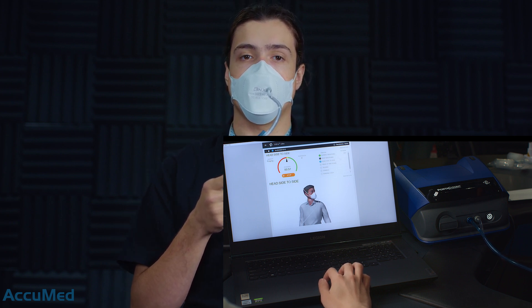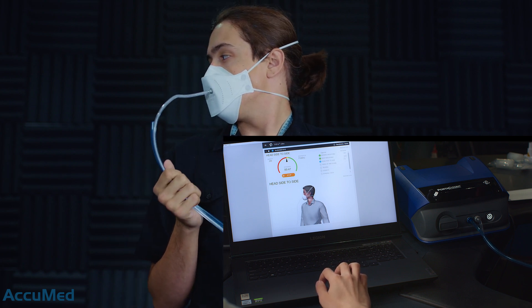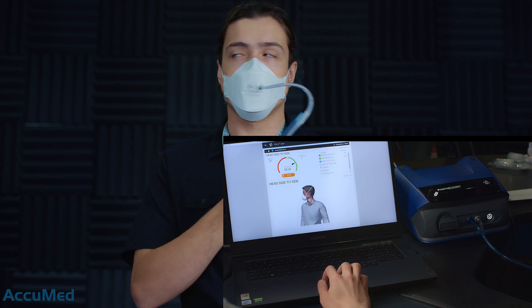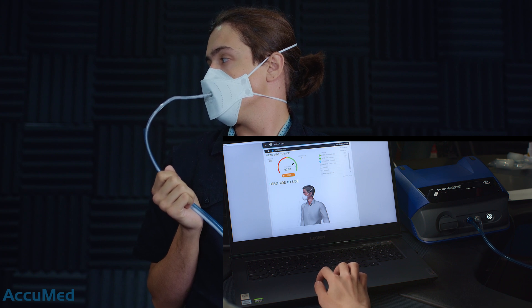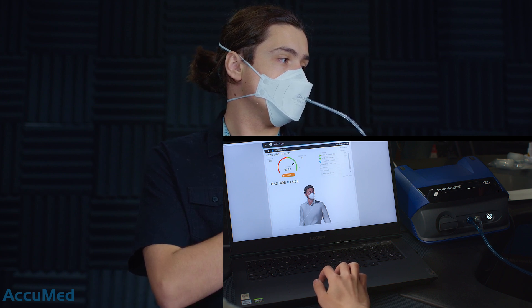Next exercise: head side to side. We have the results for the deep breathing — 200 plus again. The indicator is again in the green section, and we are expecting very good results.